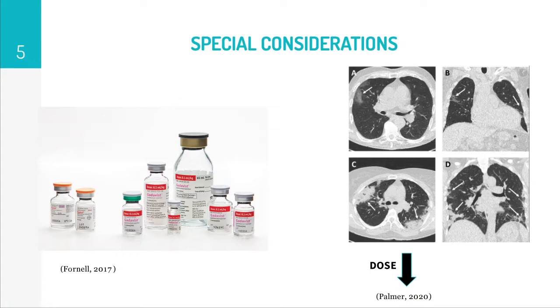A contrast-enhanced CT is performed to have a better ability in viewing certain pathologies within the mediastinum or lungs. Although a routine non-contrast CT scan of the chest is sufficient in some cases, contrast media is injected to better visualize pathologies such as pulmonary embolism. The most common type of contrast given is iodine. Unfortunately, some patients may have an allergic reaction to the contrast media and show severe side effects. If a patient feels any sort of side effect during the examination, the scanner operator must be notified immediately to pause the procedure.